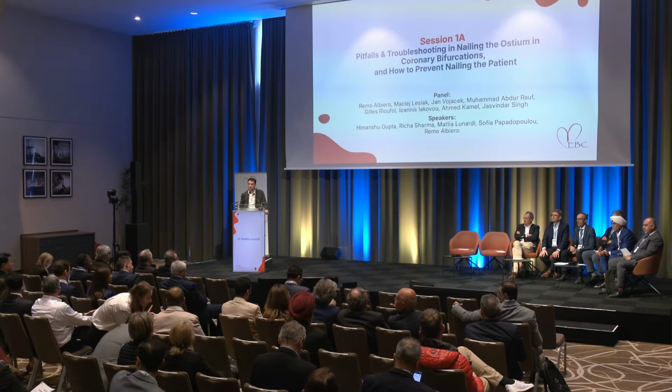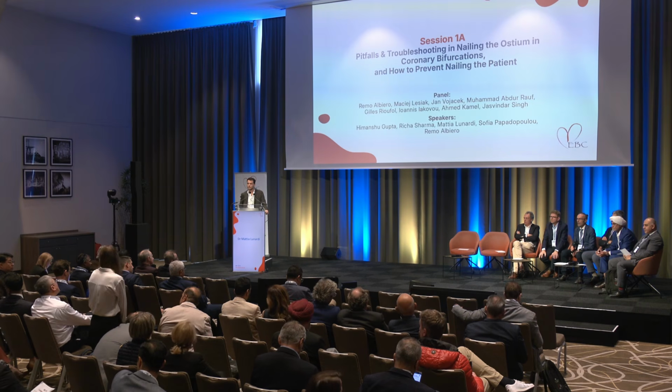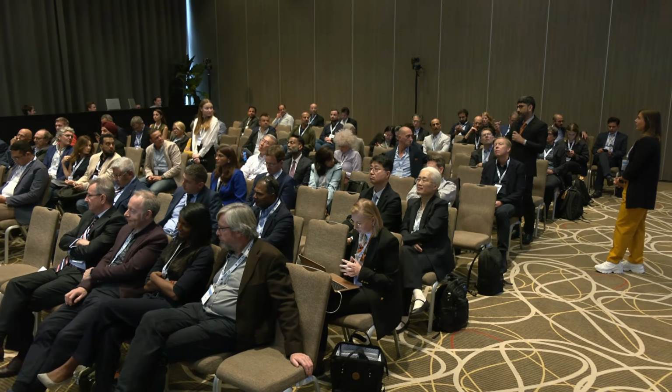I think there are two modifications. One in SABO itself, recently published: you can use a second, hydrophilic wire, make a full bend of it right from going in, push the wire in the side branch intentionally, and then pull it. You will not be able to get into the other branch ostia.